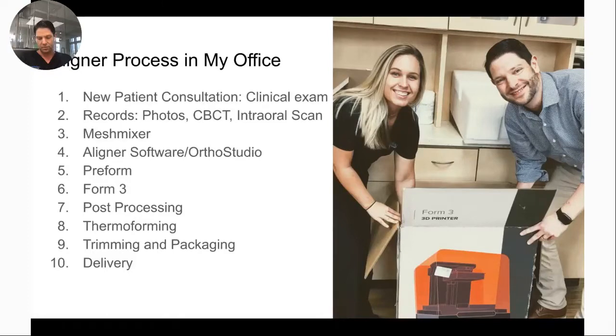Yeah, I think it's important for our colleagues out there that maybe haven't gotten into in-office aligner production, or for those that aren't dentists in the audience, to understand the overall process and how it works. It starts pretty much the same way any orthodontic consultation would, with a clinical exam and then taking records on the patient.